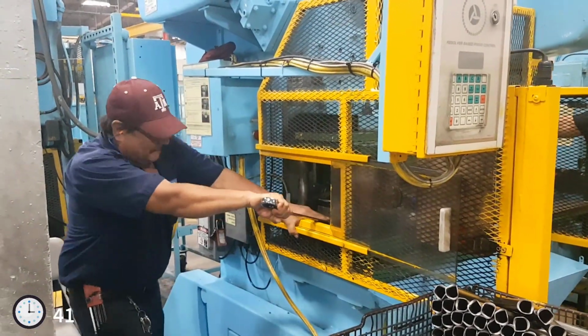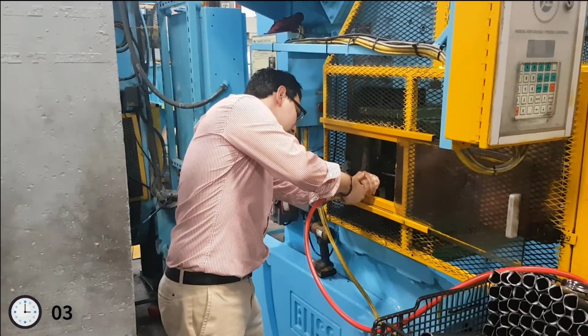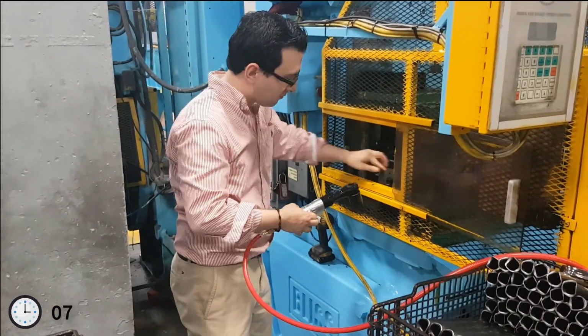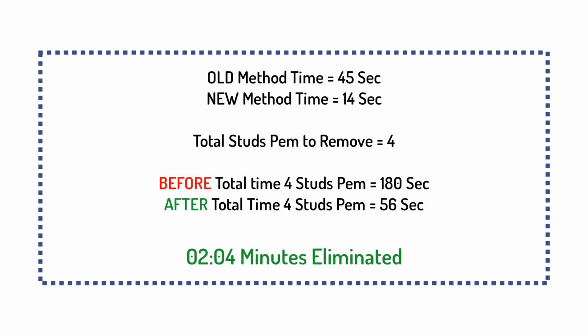After the improvements, the wrench was replaced by a pneumatic tool. As we can see here, the time drastically reduced from 45 seconds per bolt to only 14 seconds, and this includes takeoff and put on for a single bolt. This press needs a total of 4 bolts.